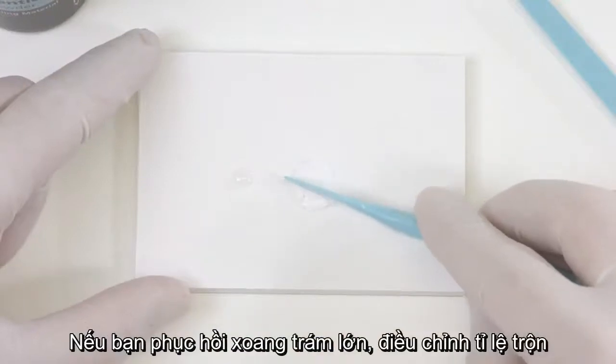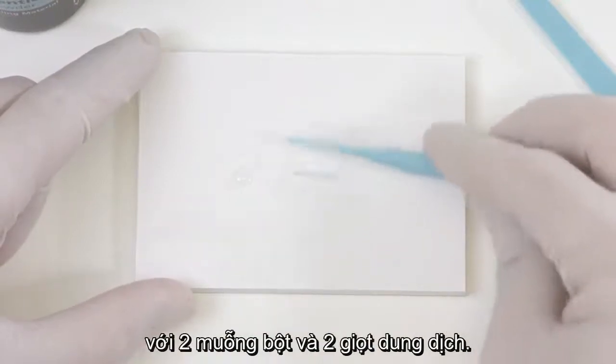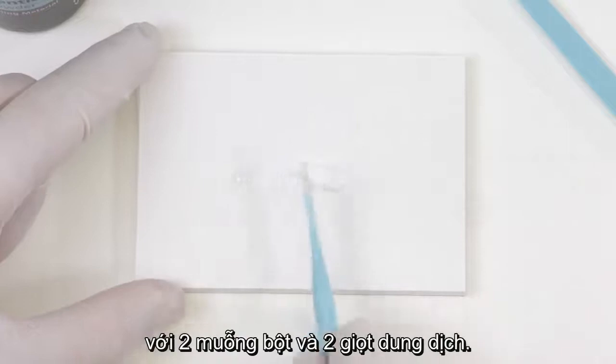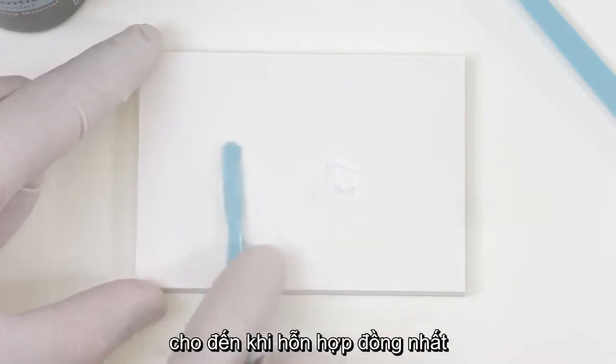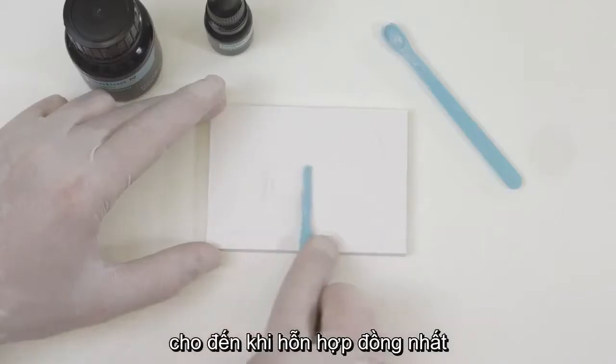If you restore a large cavity, adjust the mixing ratio using two measuring spoons of powder and two drops of liquid. Mix the powder and liquid using a plastic spatula until you have reached a homogenous mixture.